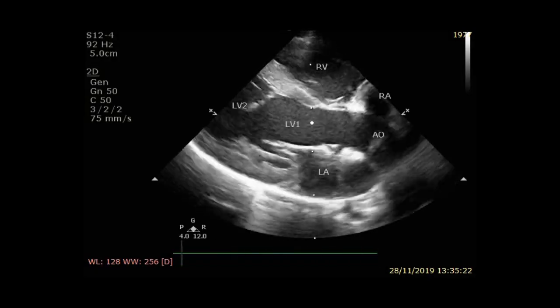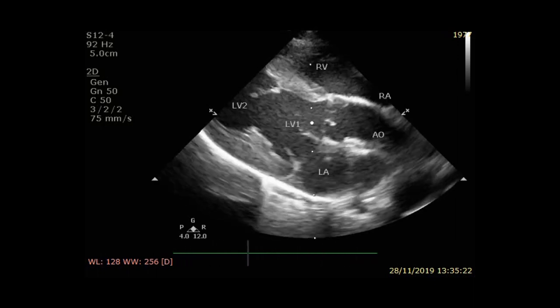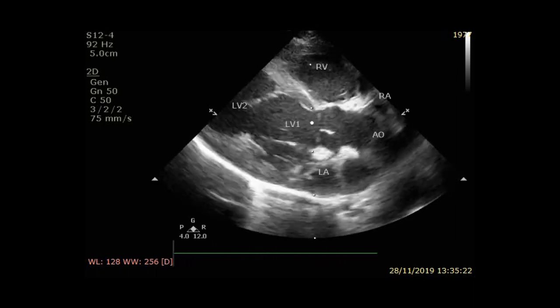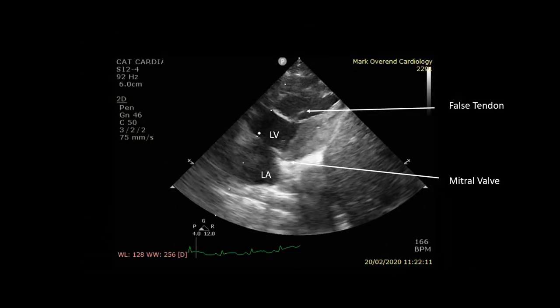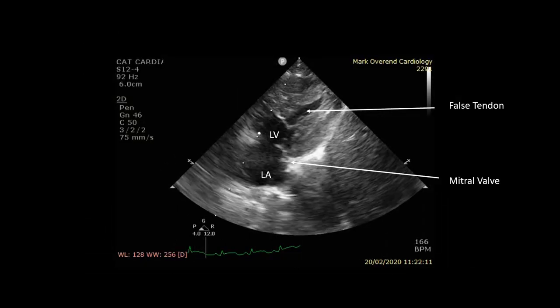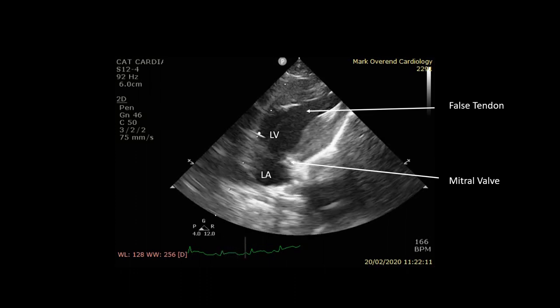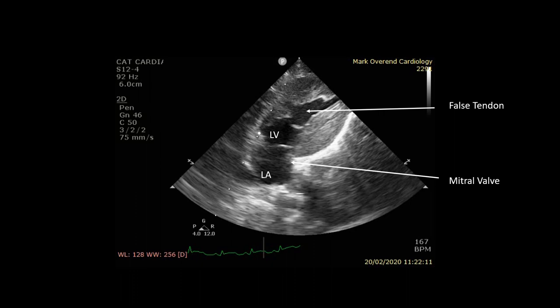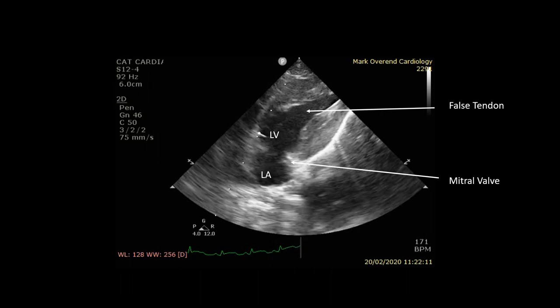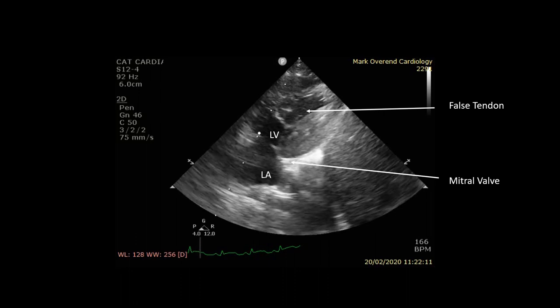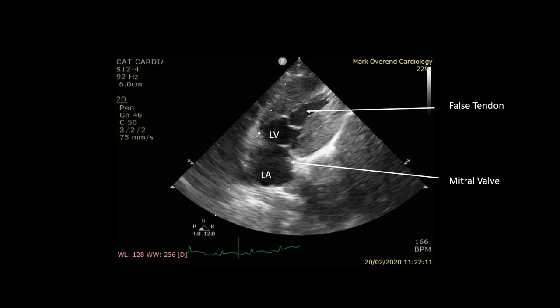The right parasternal long axis outflow view also demonstrates the obstruction nicely. This is now a left apical view with the left atrium and mitral valve at the bottom of the screen and the left ventricle at the top of the screen. In slow motion, you can see the false tendon acting like a sail in systole, which billows causing progressive left ventricular outflow tract obstruction.